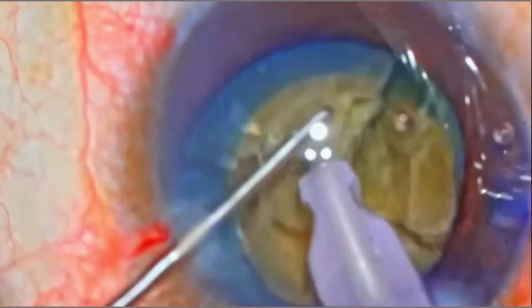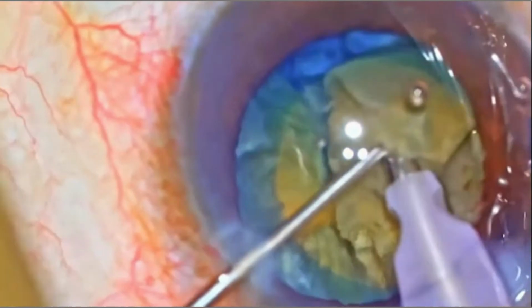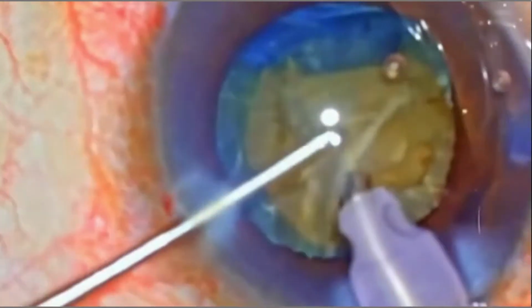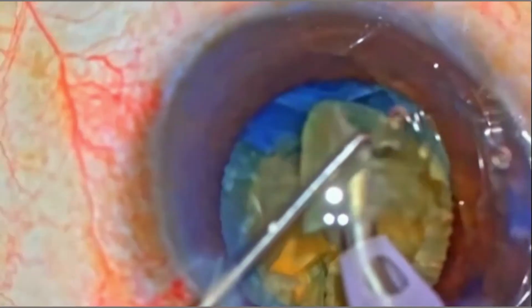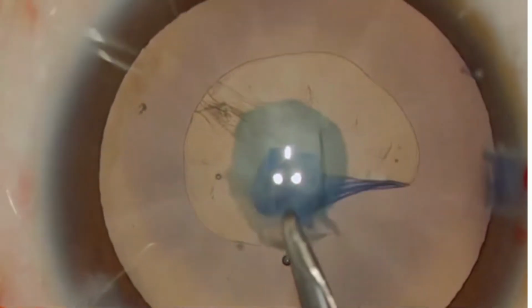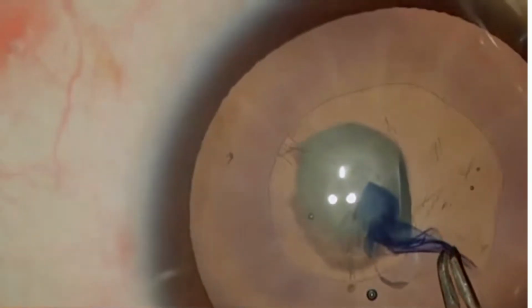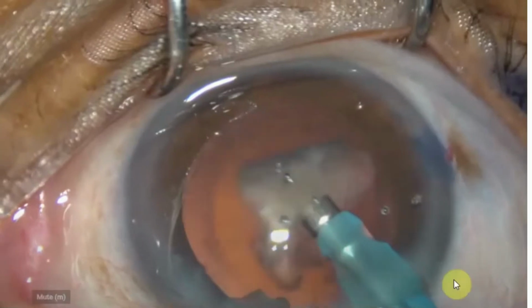Studies in animal models have found that lens fiber regeneration is faster in smaller anterior capsulotomy as compared to larger ones. Although a 5.5 mm rhexis may be the perfect size of the capsulotomy, different conditions may warrant different sizes. For dense cataracts, a larger rhexis is preferable. A slightly smaller rhexis in posterior polar cataracts is better than a larger one. The latter is done to ensure that lens implantation in the sulcus can still be done, even in the event of a posterior capsular rent.